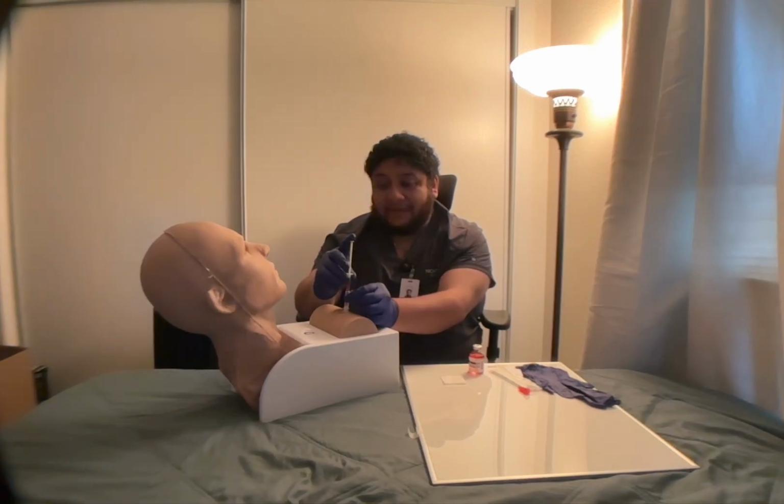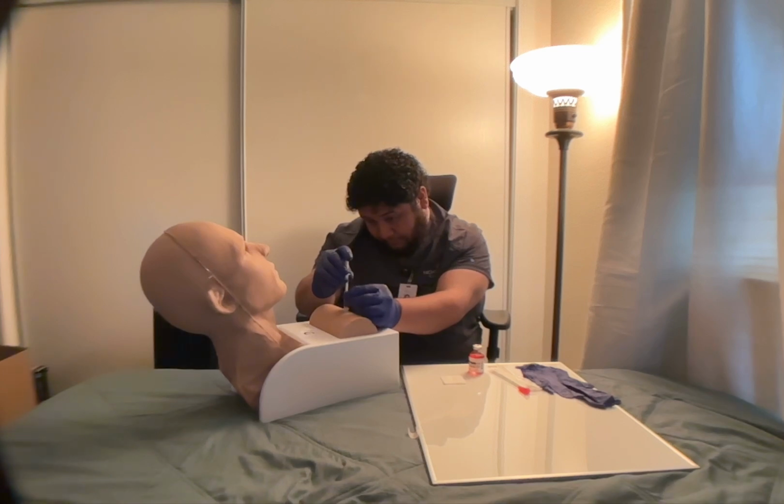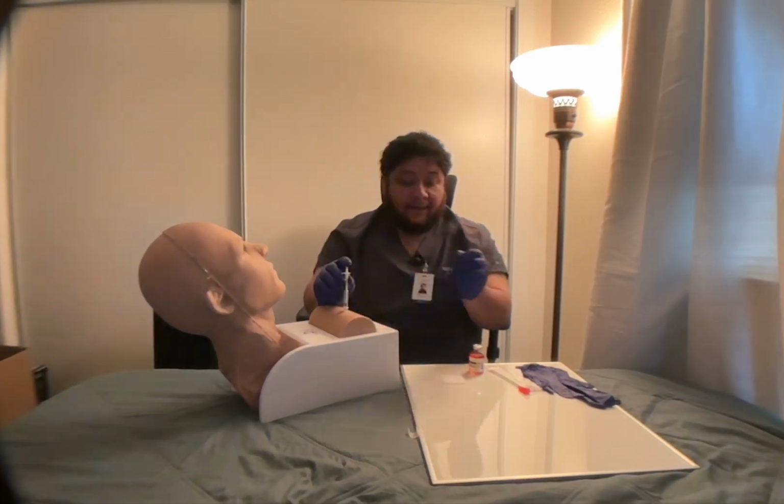It should take over 30 seconds, so take my time. Okay, medication is fully administered.